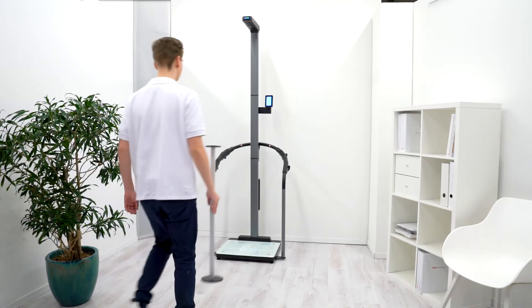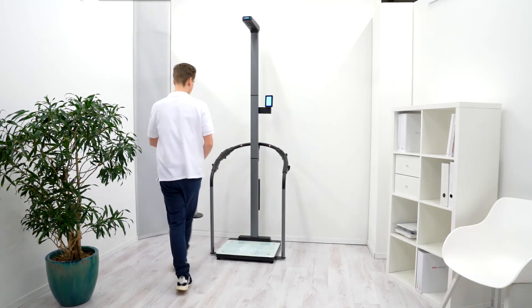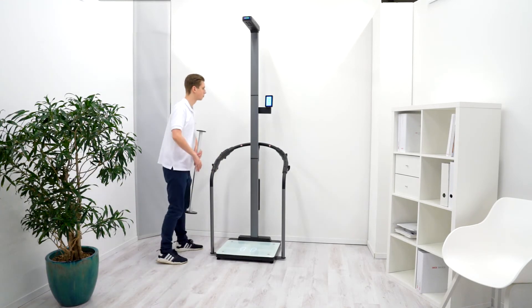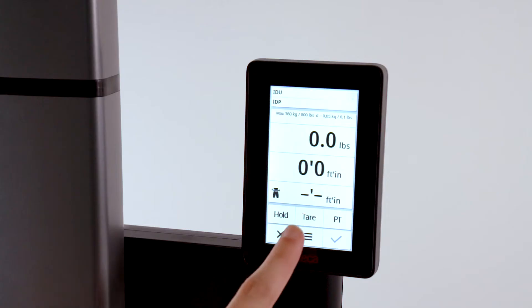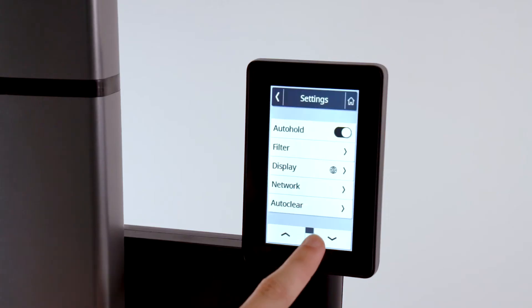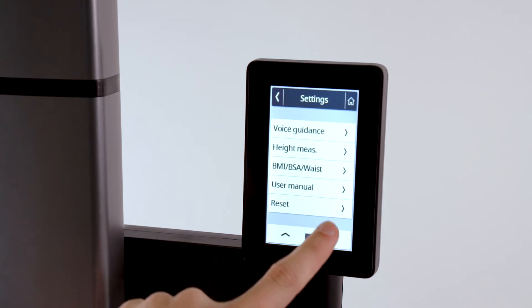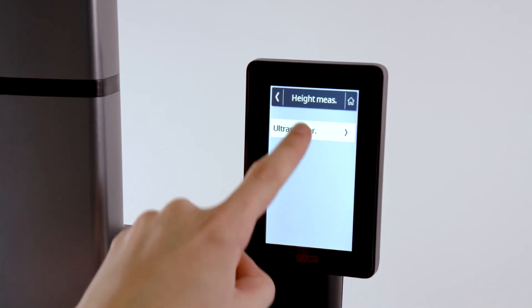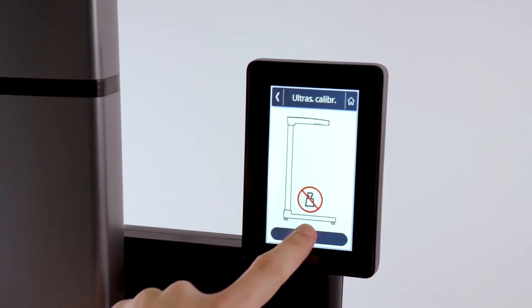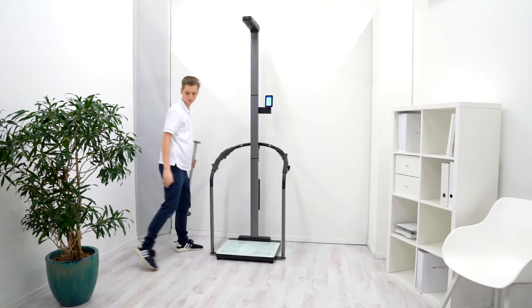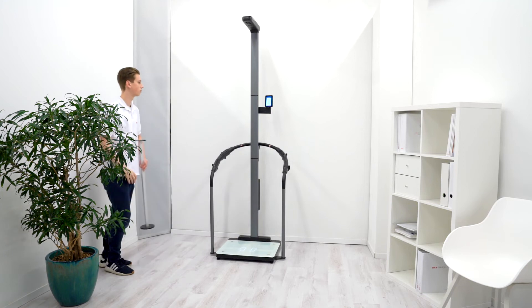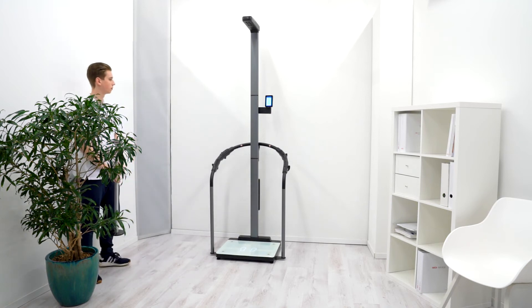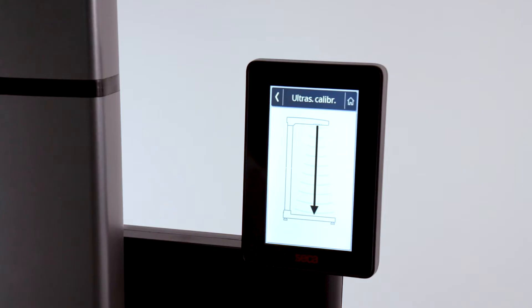Before performing a measurement with the device for the first time, please calibrate the ultrasonic height measurement probe. To do this, first go to the menu and perform a calibration measurement with an empty platform. You must keep a distance of 50 centimeters.